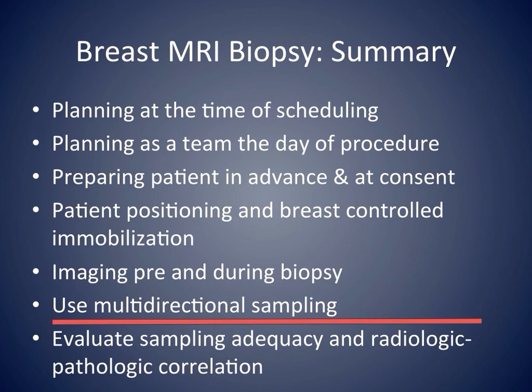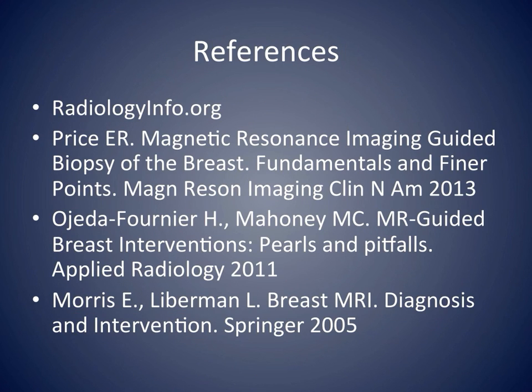Lastly, after the biopsy, it's very important to review the MR imaging entirely, correlate mammogram and MRI, and perform a careful radiologic pathologic correlation. This concludes the basic biopsy technique section.